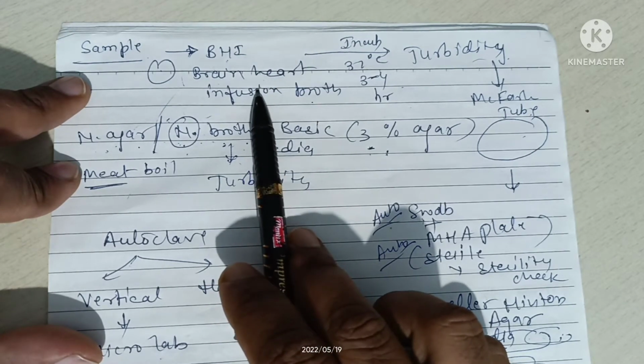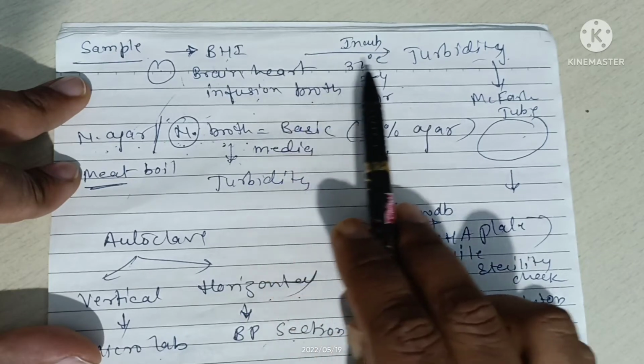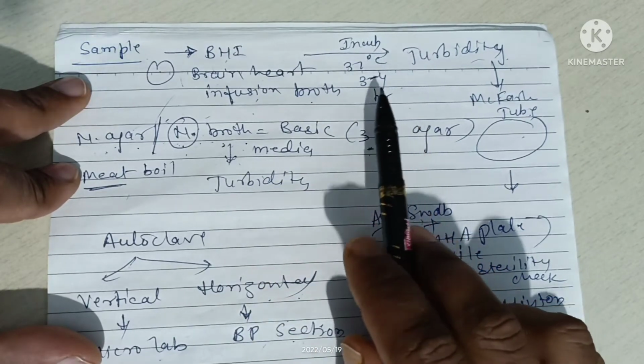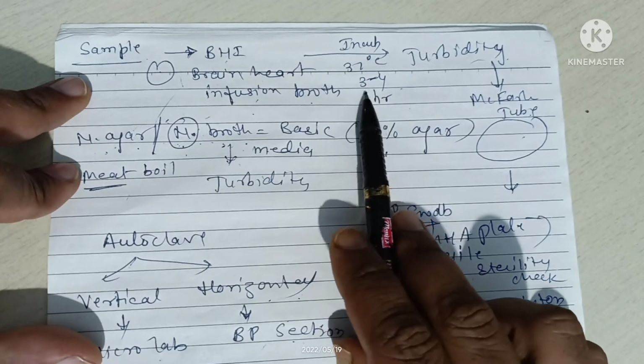It is an enrichment broth, and after inoculation into the BHI, we put it at 37 degrees centigrade for 3 to 4 hours for incubation. Why is the incubation required for only 3 to 4 hours?